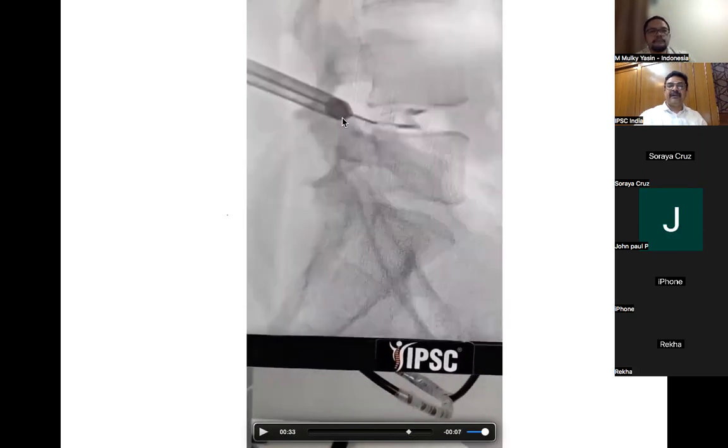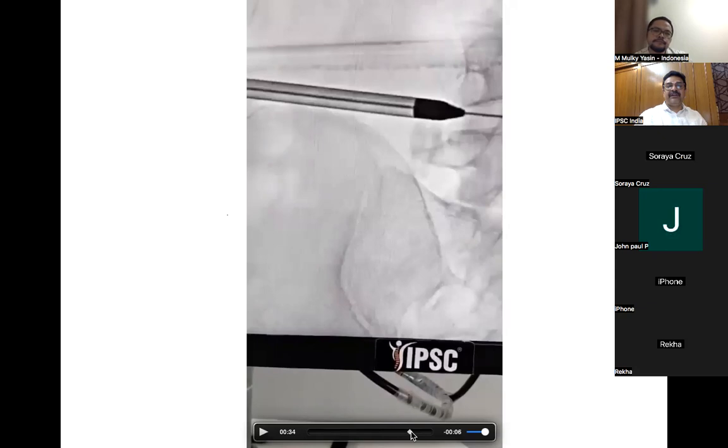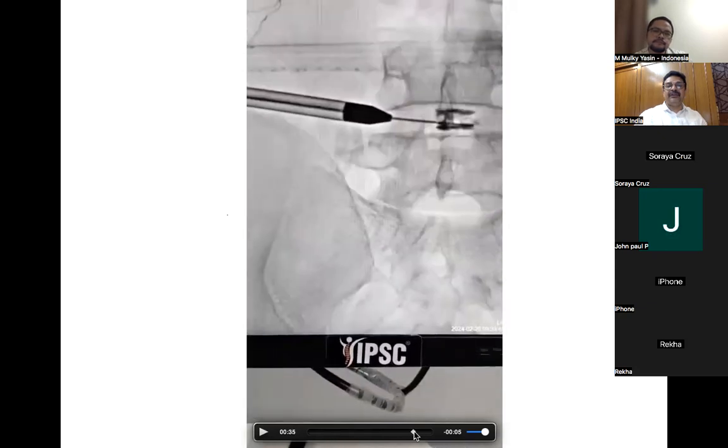Now where are we right now? Where is the dilator now? We are just at the SAP. Now you can see this. We are just at the SAP over here.